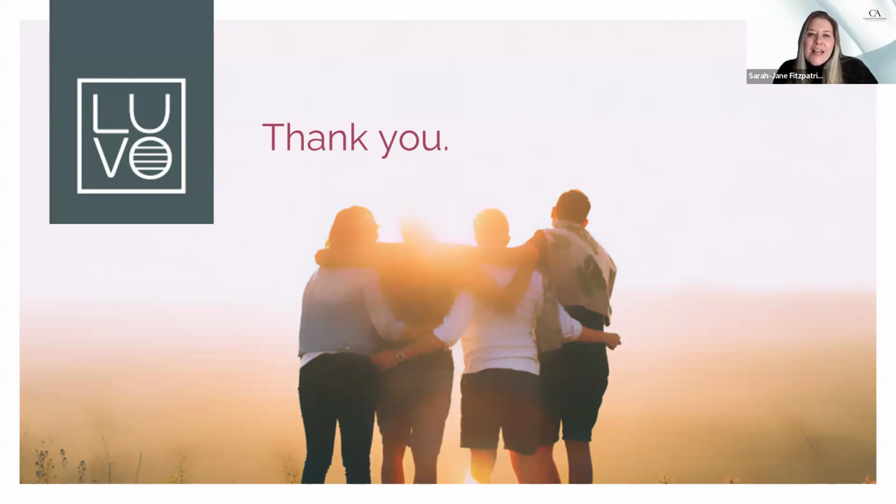Excellent, thank you. Okay, so is toning 1 or 2 passes? If you're going to just do toning, like if you wanted to do a 640 toning and a 585 toning, I don't see why you couldn't do that. But then I would probably be coming in more, well, no, I'd do a single or a double as well. It depended. I would do double if it was vascular, and I would still do single if it was pigment. But it's just, again, looking at why would I choose that.